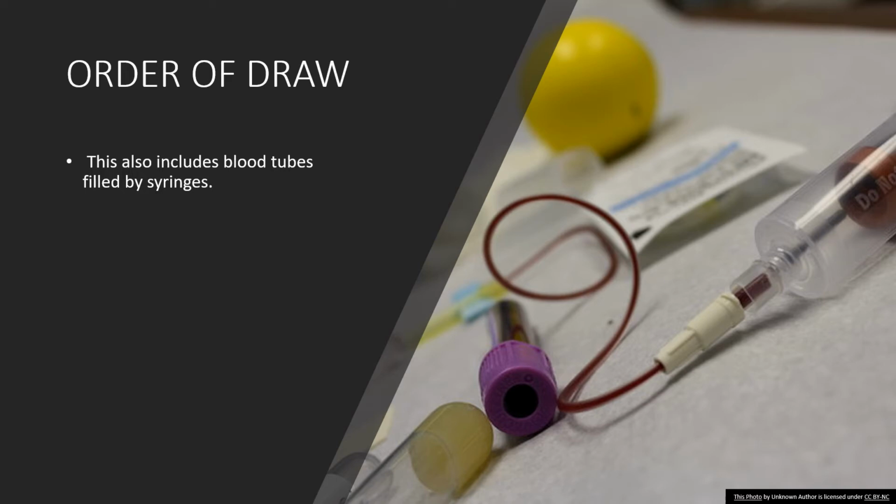And there are other things that we will go over, safety equipment that's out there that you can use if you were to have to do that. But this is the safest way to do it, and it ensures that with those Vacutainer tubes, like I told you before, they're set to draw a certain amount of blood. So with certain tubes, like your light blue top tube, you need to draw those at 100%. The ratio needs to be correct between anticoagulant and blood. So you want to make sure that when you push it onto the Vacutainer system, you wait until it stops drawing any blood before you switch it out into another tube.